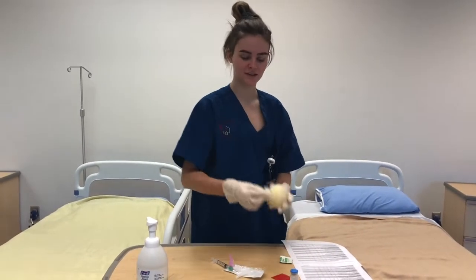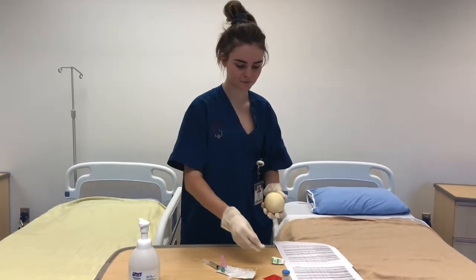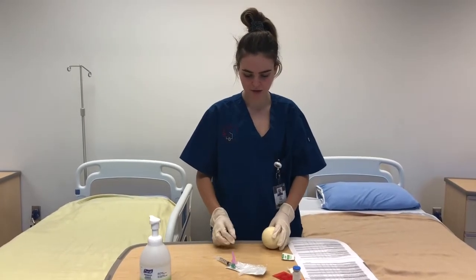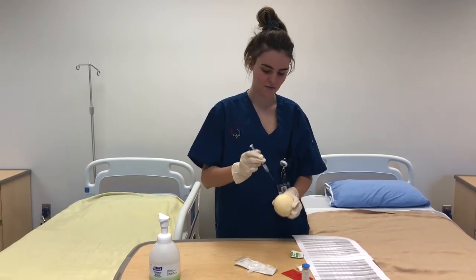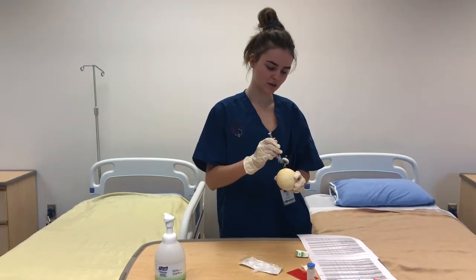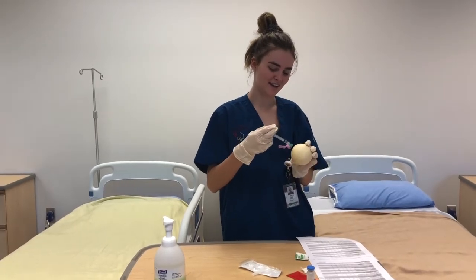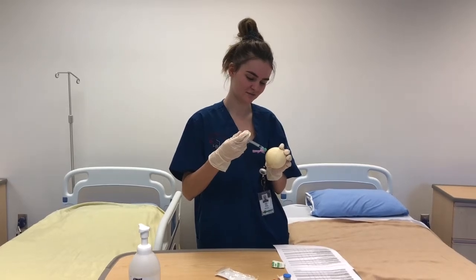And now we're going to be cleaning the injection site on Mr. Mancini. And so Mr. Mancini, we're going to be giving your Haldol now, which will go in your upper arm. And yeah, so this at a 90-degree angle. We're going to go 3, 2, 1 and push it in all the way until you feel muscle, and then inserting the 0.5 milliliters of Haldol.